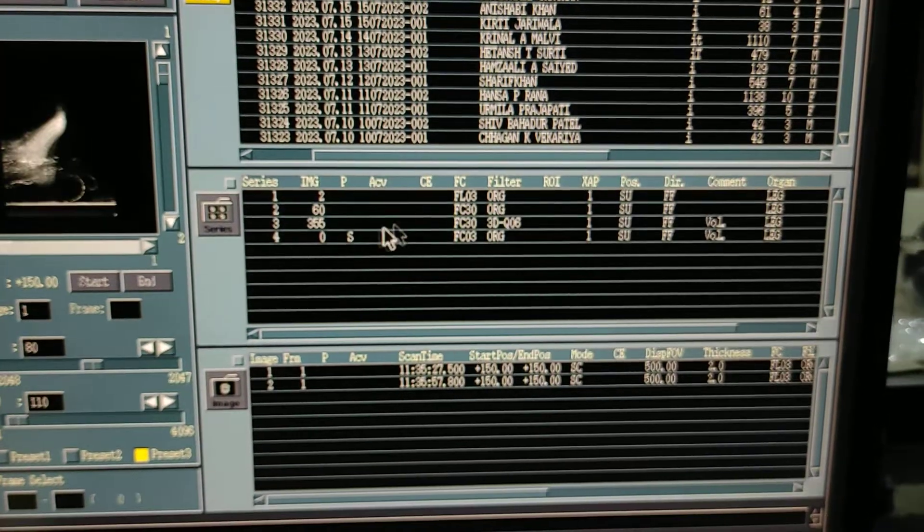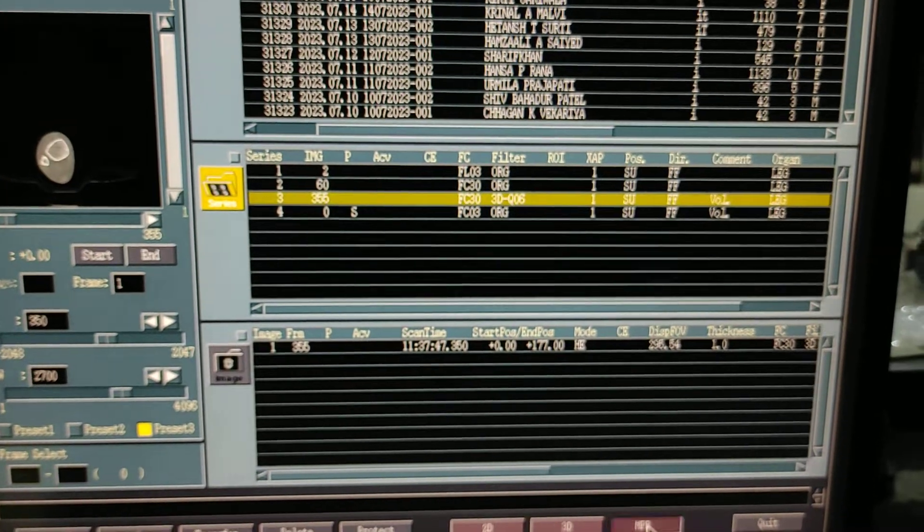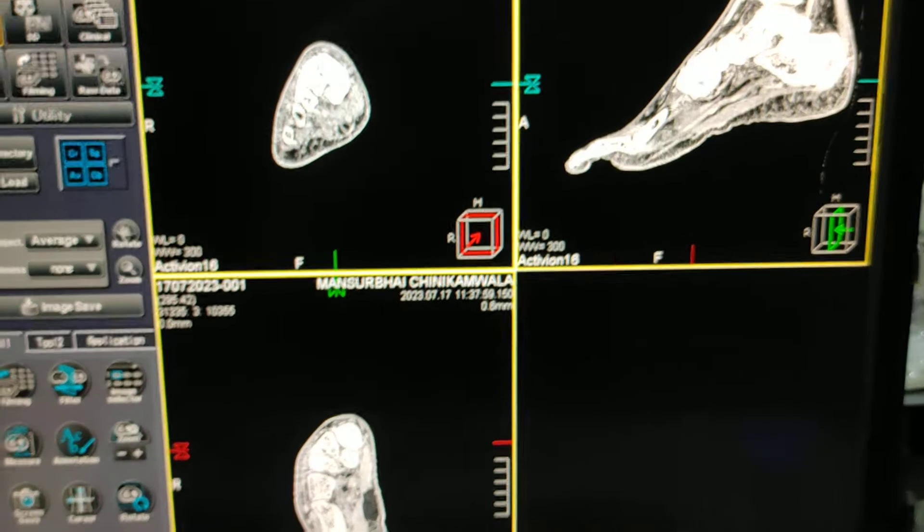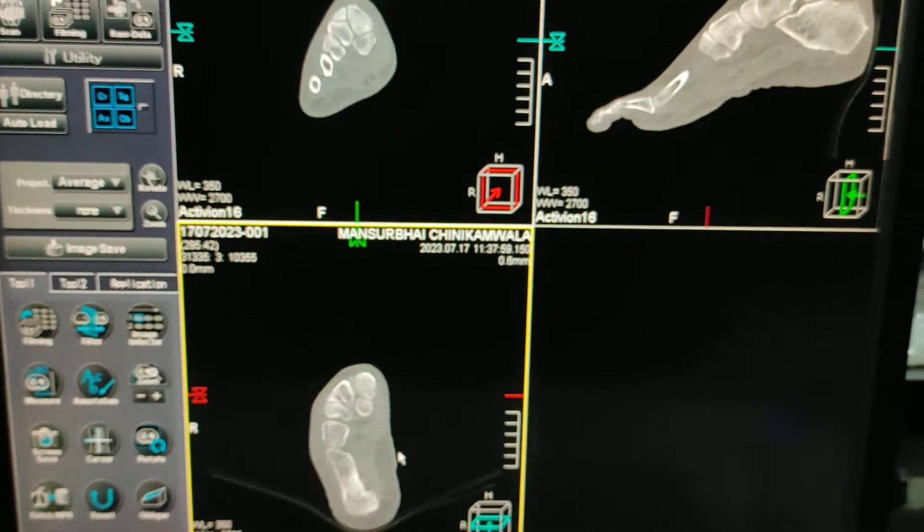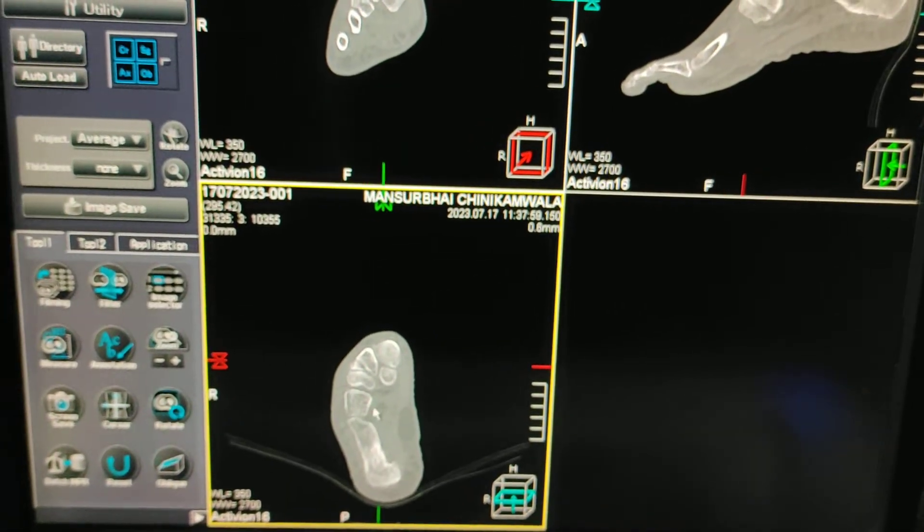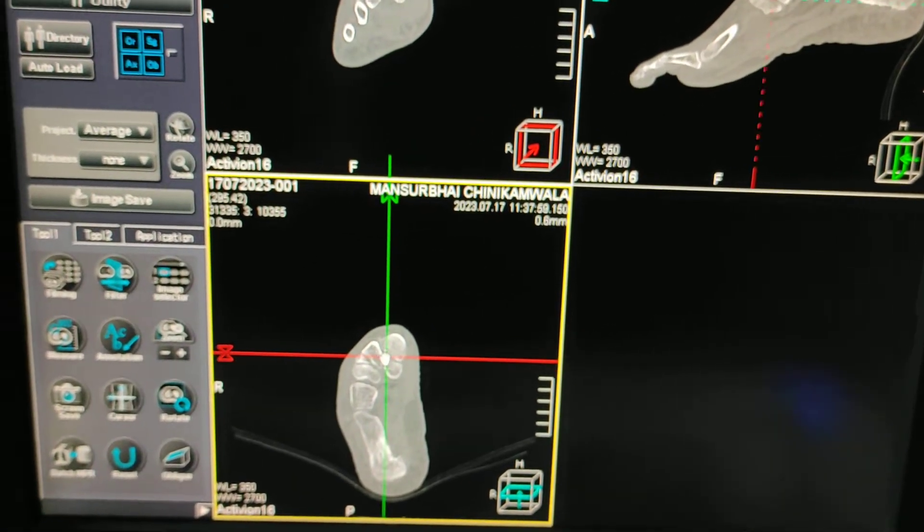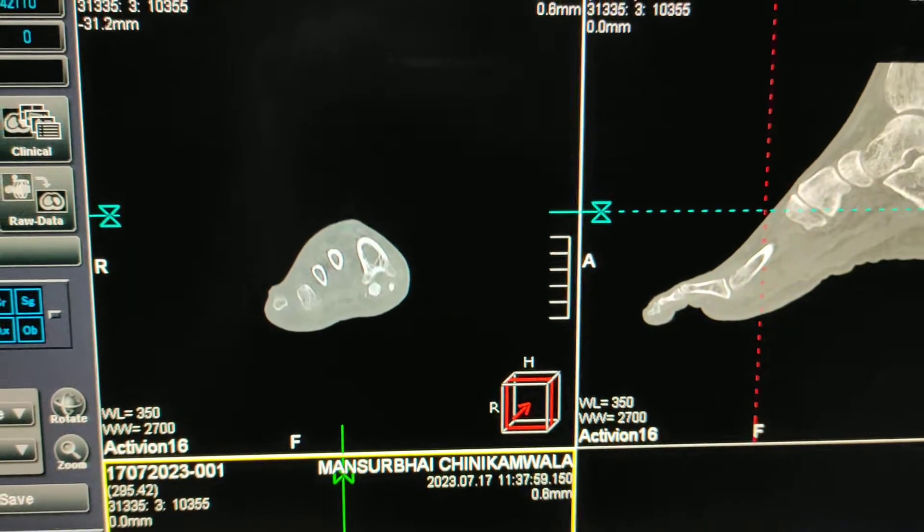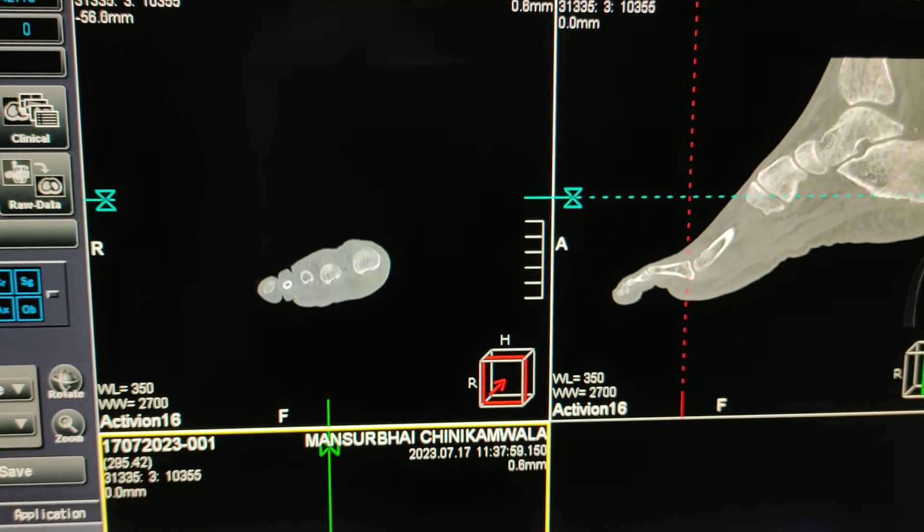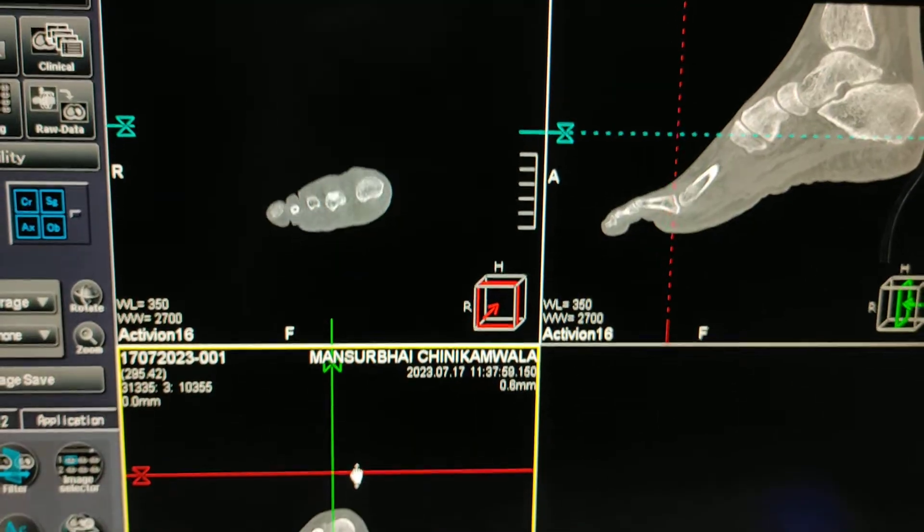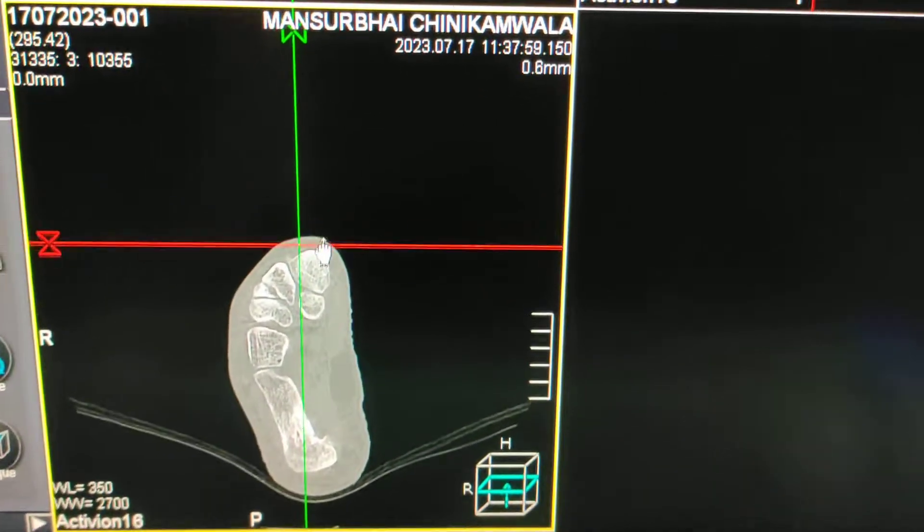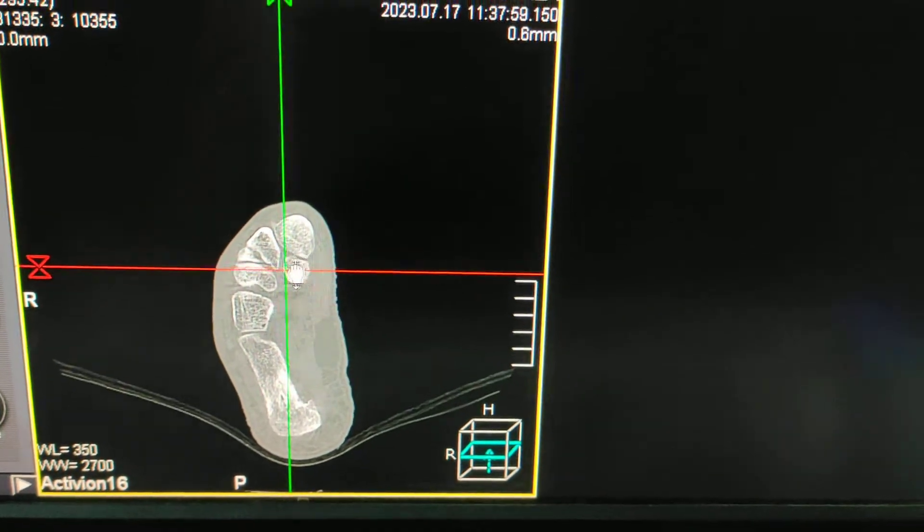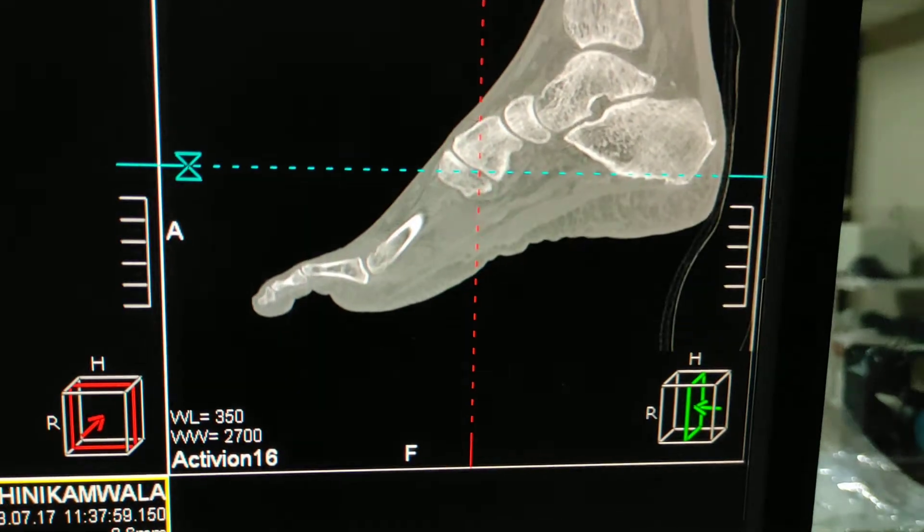I will check the images whether there is movement or not. I am loading in MPR to check the sagittal and coronal images. You can see there is no such motion artifacts. This is a general image.